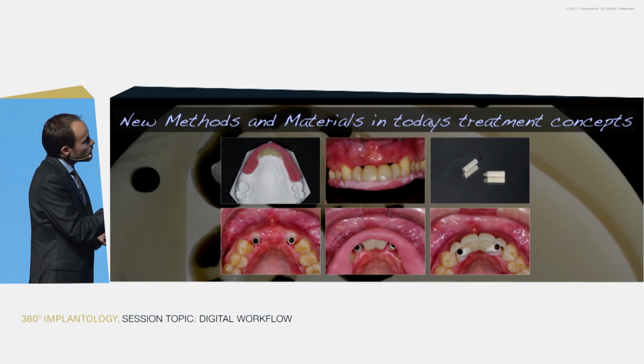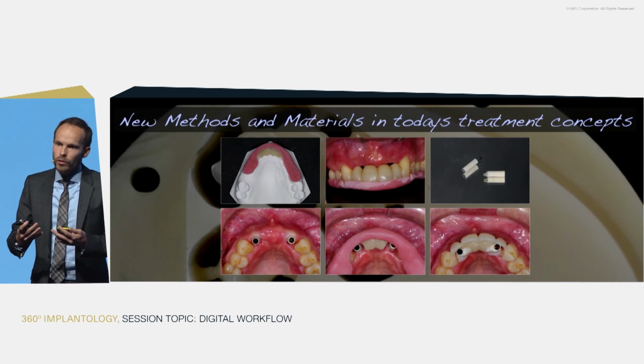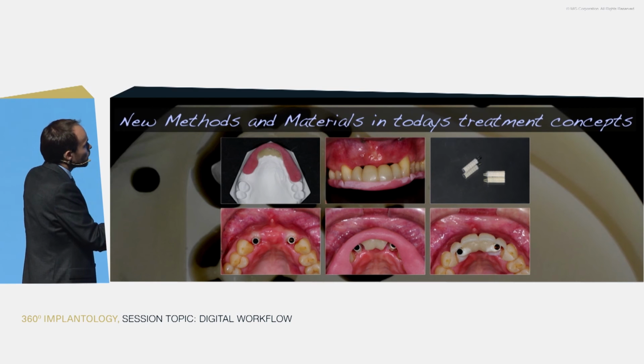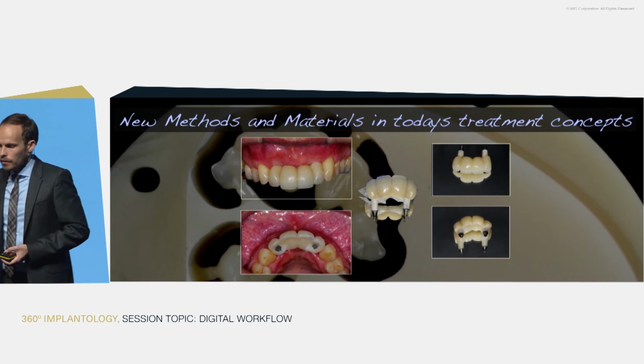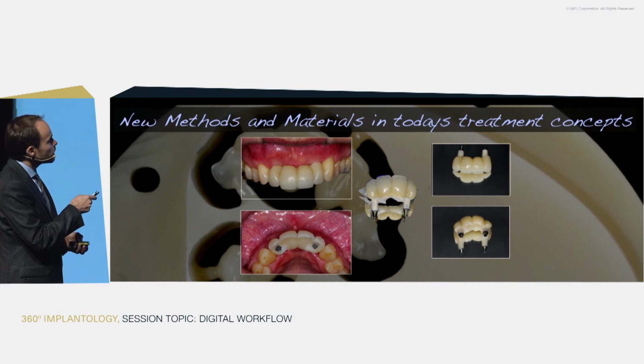We understood in these days that we have to apply the opaque material, the composite opaque, in order to avoid the grayish discoloration of our provisionals. We relined the whole provisional here and united with the provisional abutments. And as you can see here, there's the first limitations.